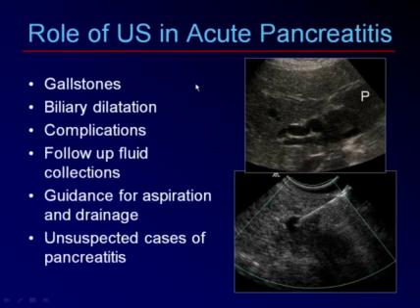Now, what is the role of ultrasound in patients with acute pancreatitis? Well, it's not so much the imaging of the gland, it's all the other things. First of all, gallstones. Patients who have gallstones can have recurrent bouts of acute pancreatitis.